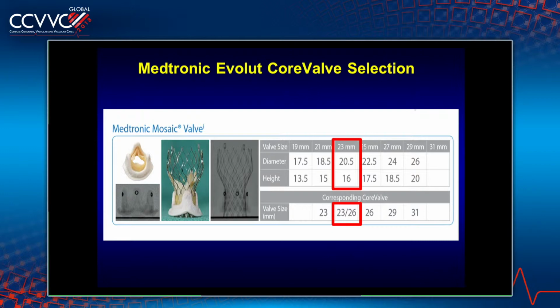Eberhard is shaking his head like you're crazy. I'm glad he's bringing this up because I was waiting for this cracking thing. And I think, why don't we just be a little bit more careful, just say cracking it. You have to have a reason to crack something. Apart from the fact that if you put a valve in and you do have a gradient that's too high, then I think it's quite all right. If you start out, let's crack the valve, I don't see a good reason to do it before you even know what the gradient is.